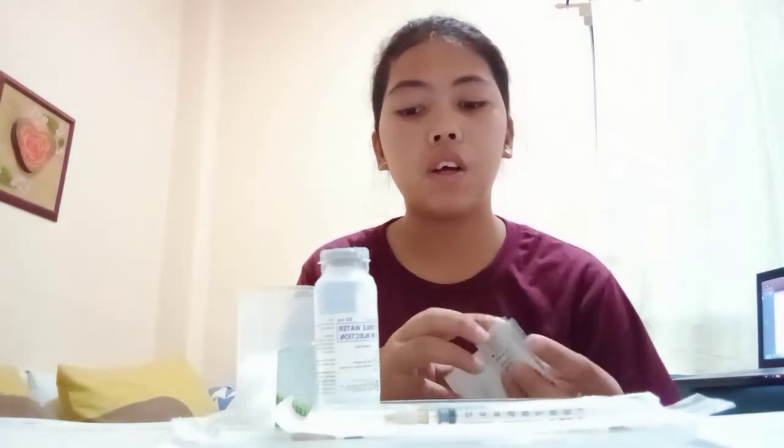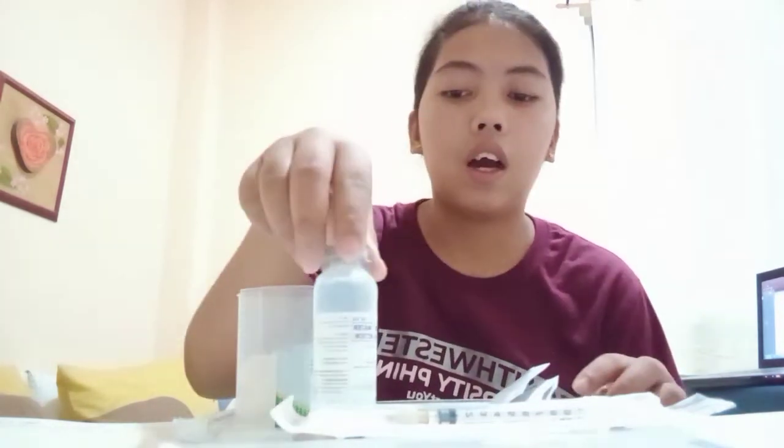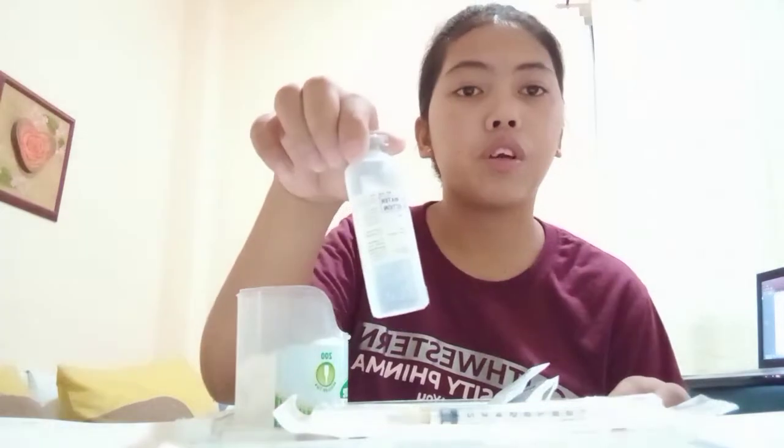Before we proceed to the procedure, we should have the equipment needed for administering intradermal injection for skin test. We should have a syringe which measures 1 ml. This is a tuberculin syringe, and we have alcohol swabs and sterile water for the skin test.